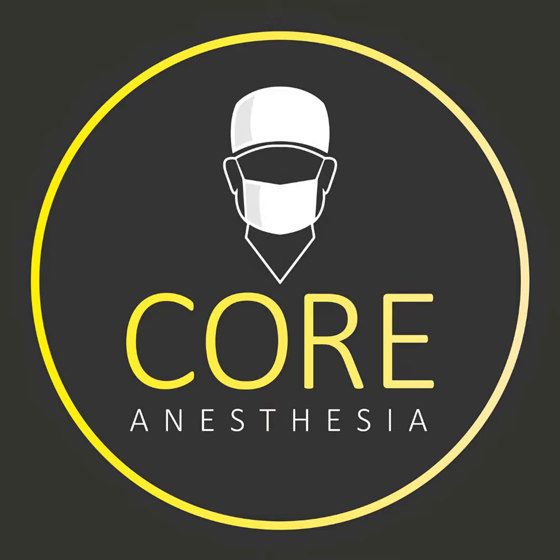You could be giving the patient huge tidal volumes. So you could have a huge minute ventilation. You could be driving their end tidal way down because you're just giving them such big tidal volumes. So it goes on both sides of the coin here if you're going to have somebody with good compliance or bad compliance. The volume is going to change based on the pressure limit for each breath.